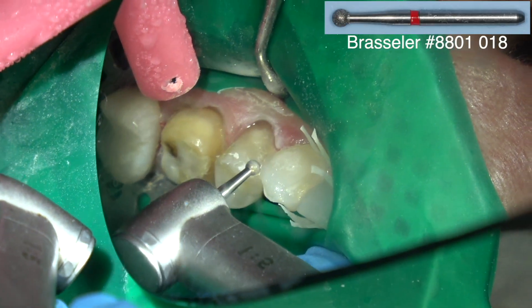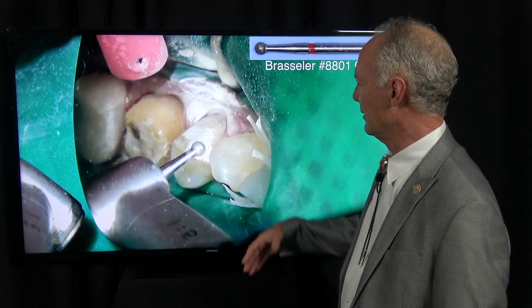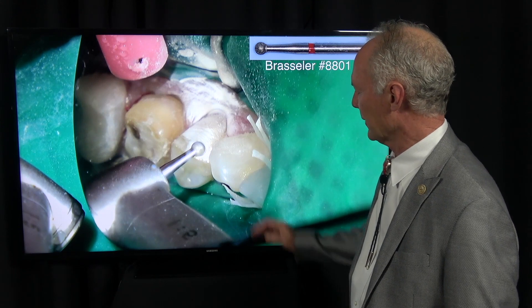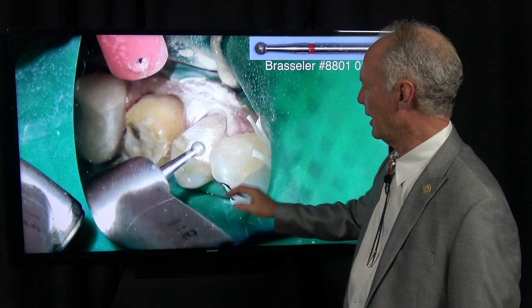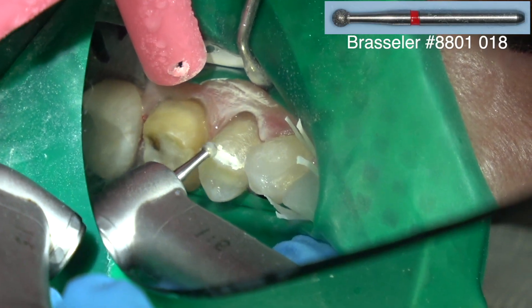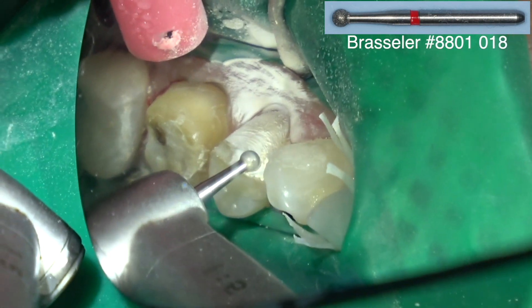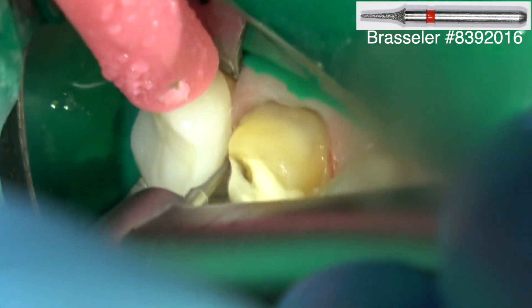Now this is a seeding lug — I call it that — on the bicuspid teeth on the facial aspect. The objective of this lug is: number one, it protects the occlusal margin of the veneer, and number two, you have a definitive seeding stop. Only breaking the contact between cuspid to cuspid — mesial of the right cuspid, mesial of the left cuspid, and then in between the other anterior teeth. And I talk about why in my video on wrapping.